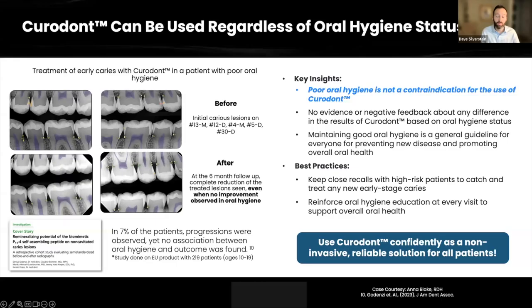And if this medicine is placed correctly on these lesions, we will see the generation of new hydroxyapatite on these areas. Now, will that mean that that tooth is treated for life and the patient has no future problems in that spot? No. It's just saying that it does make a benefit on these patients. And even if you have somebody who doesn't have exceptional Olympic level home care, as I like to say, this is still a product that will benefit the tooth structure regardless. Okay.